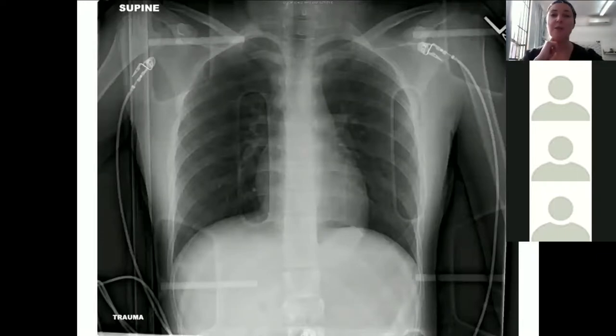Next example, you've got a patient who's come in, trachea looks central, lung fields look good, circulation looks good, your cardiothoracic ratio is normal, diaphragms look great. But there's something interesting here. You've got some ECG leads on. So this is a little bit odd. There's something going on. This patient's not well if they're on monitors. And then can you see, this looks like there's some artifact here. And if you look nice and closely, this patient's lying on a spinal board. So I think this is probably a trauma patient that's lying on a spinal board.